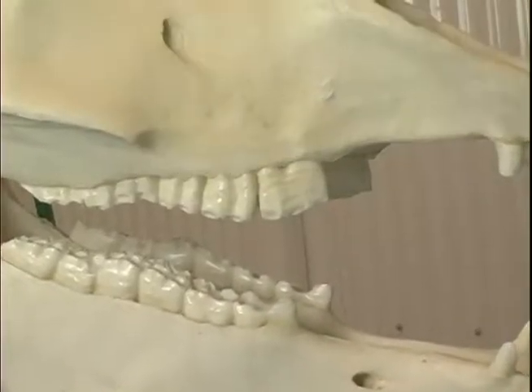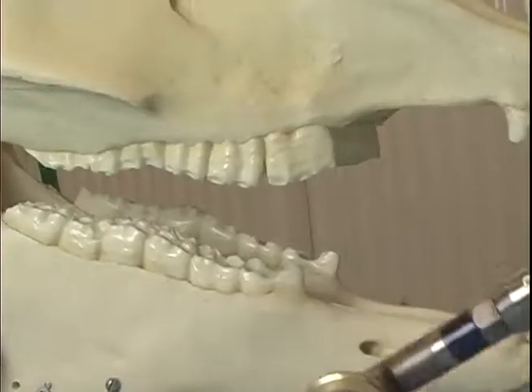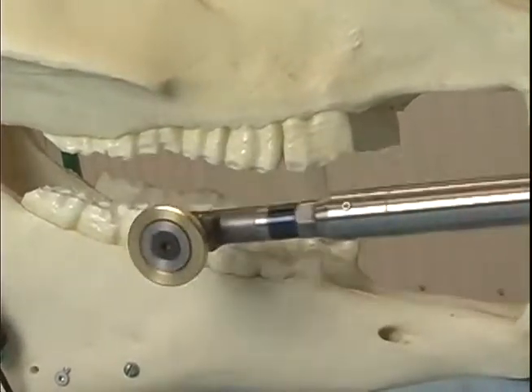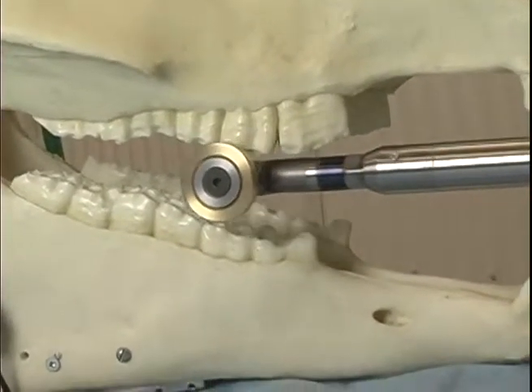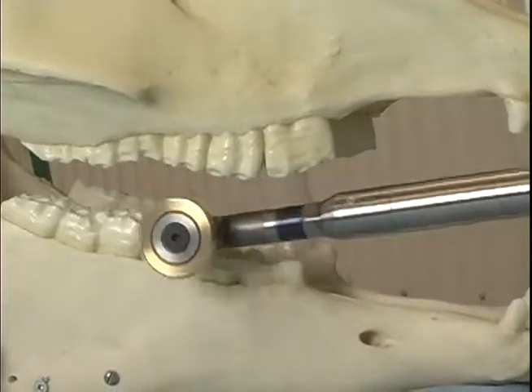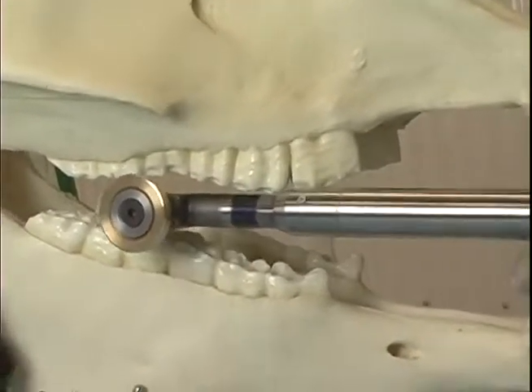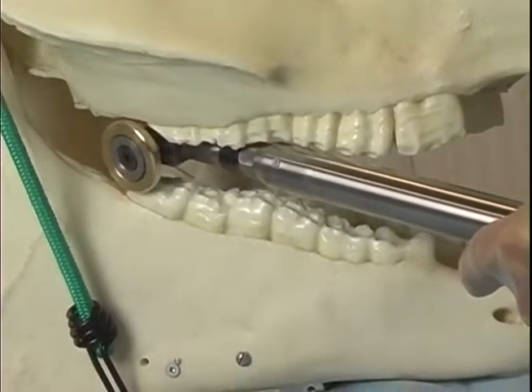The chamfer burr. The key feature of the chamfer burr is it's introduced into the mouth, and you can see that it gets really tight against the teeth. In a straight up and down position, it gets really tight against the teeth. So it's introduced into the mouth, and you float off the sharp enamel points all the way to the back. It'll even go around the corner just a little bit.